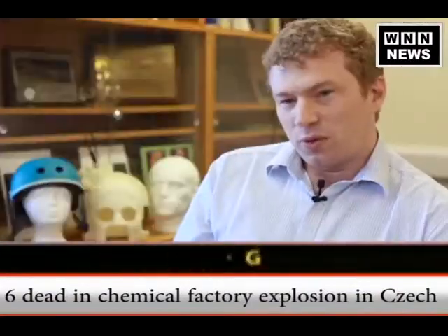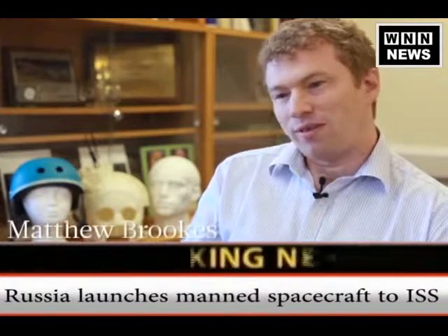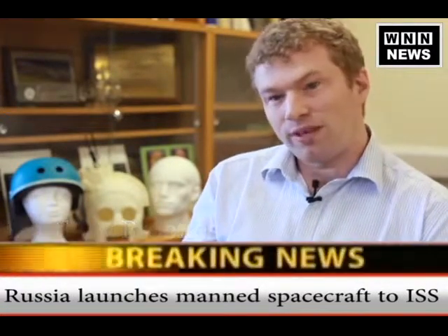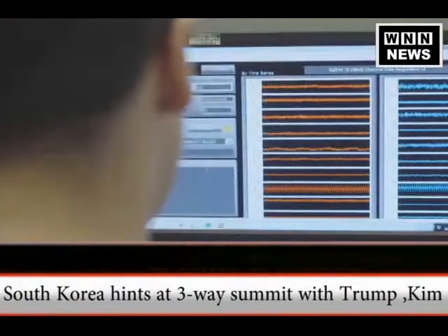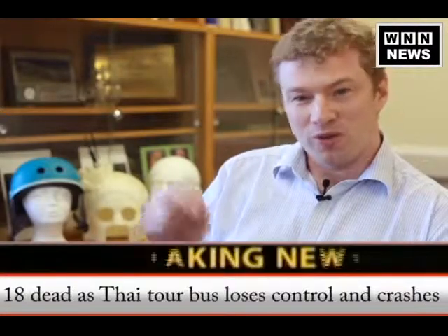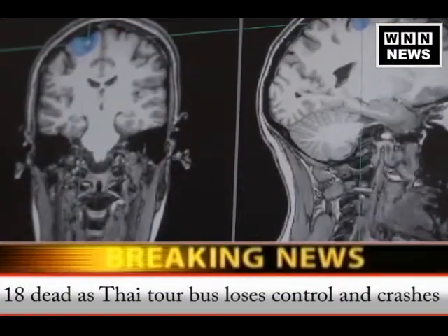So at the moment, if we want to measure what the brain's doing, if we want to measure brain function, there are a few ways of doing it, but one way is magnetoencephalography, or MEG. The idea of MEG is that we measure magnetic fields that exist outside the head that are generated by current flow in the brain. And in that way, we can work out what the brain was doing at any one time.